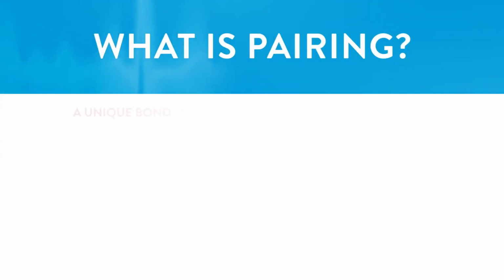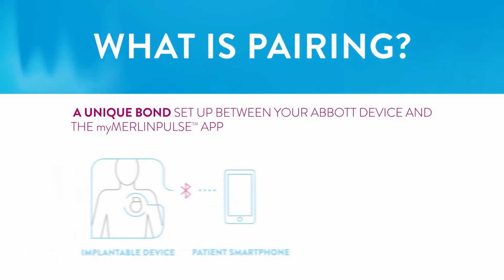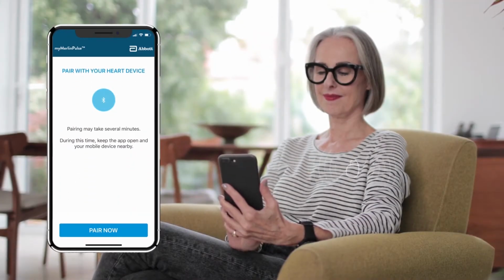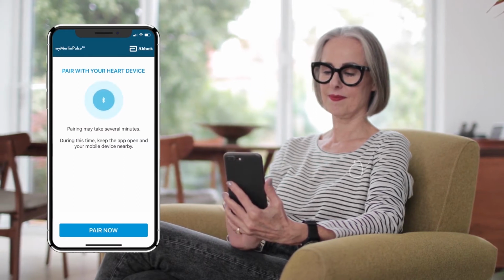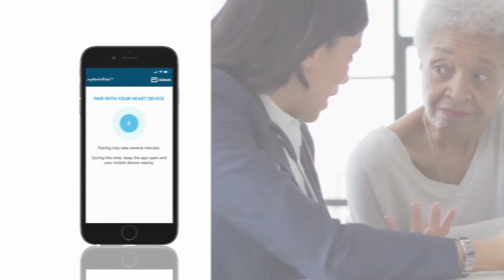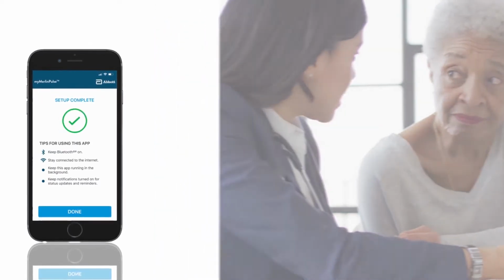What is pairing? Pairing is a unique bond setup between your Abbott device and the myMerlinPulse app on your iPhone, so they can communicate. Pairing cannot take place until after your device is implanted. Pairing is needed when you set up the app on your smartphone for the first time. Someone from your care team will help you pair your device with your iPhone after your procedure.